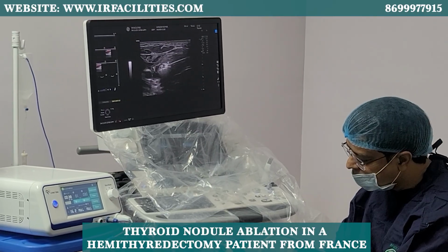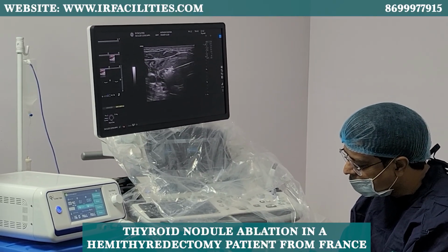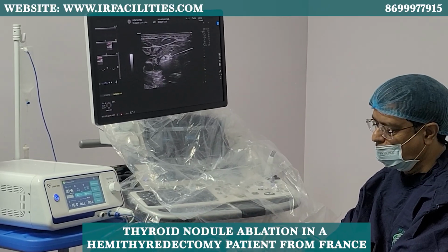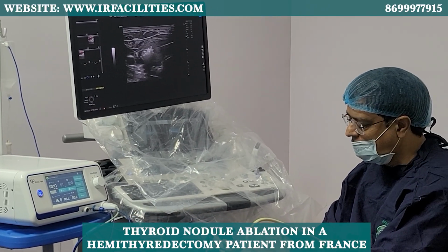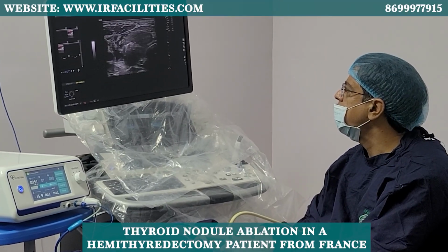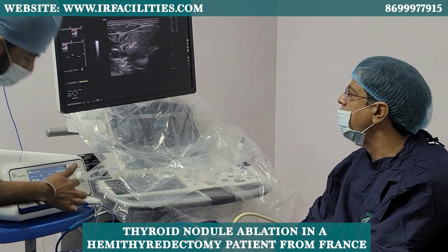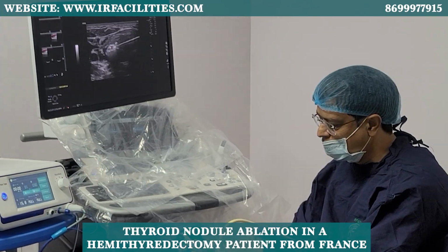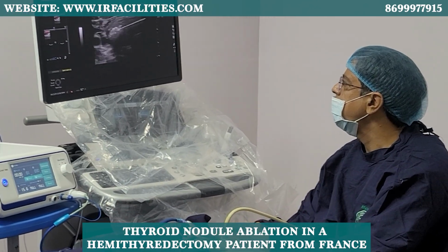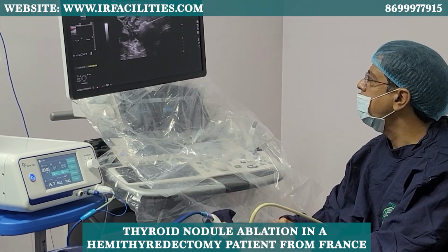Any pain? Heat? It's bearable. Bearable. Do you have any heat? I mean, you're feeling hot? It's not hot, but it's like a sparking. Sparking? Yeah. Inside? Yeah. It's a laser thing. So I just hope you are not bugged too much by that.